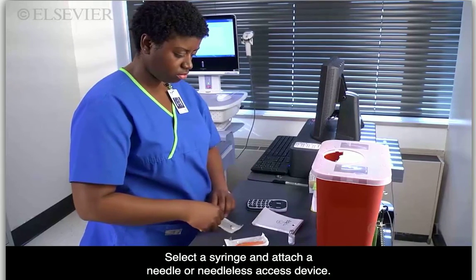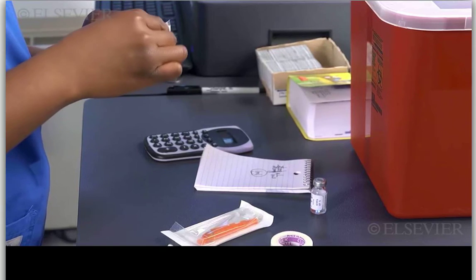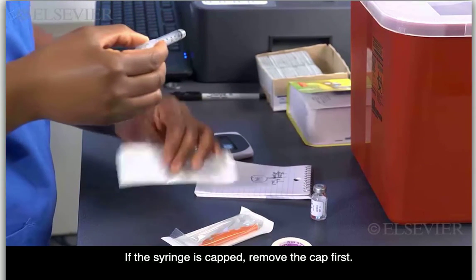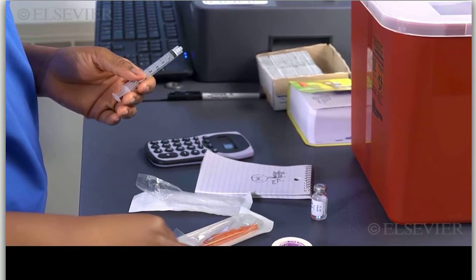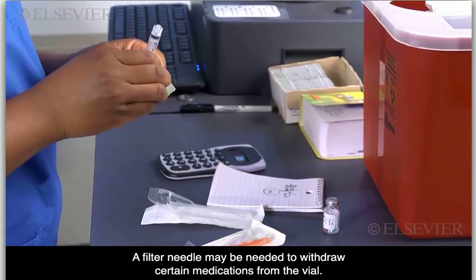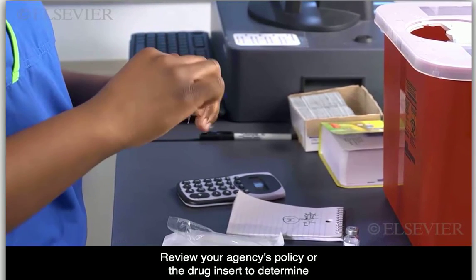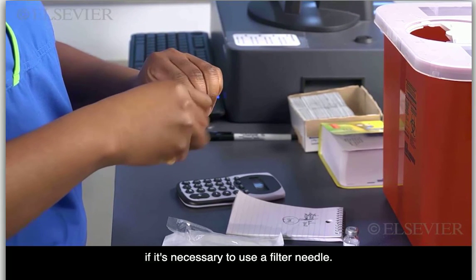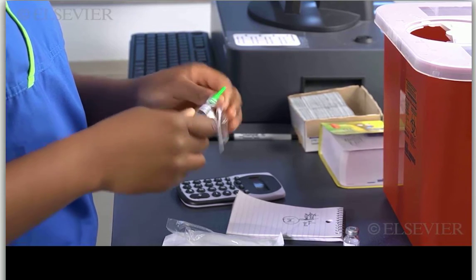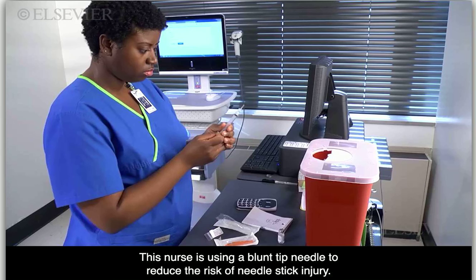Select a syringe and attach a needle or needleless access device. If the syringe is capped, remove the cap first. A filter needle may be needed to withdraw certain medications from the vial. Review your agency's policy or the drug insert to determine if it's necessary to use a filter needle. This nurse is using a blunt tip needle to reduce the risk of needle stick injury.